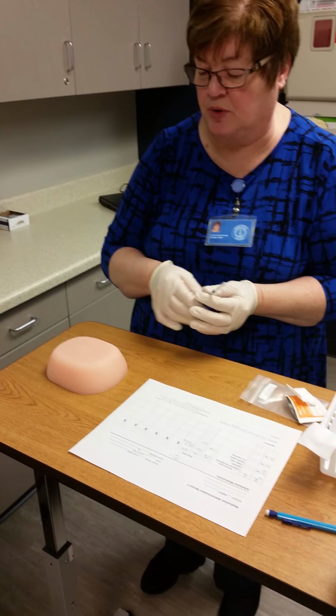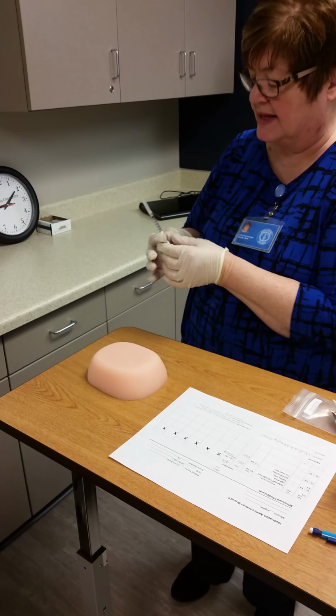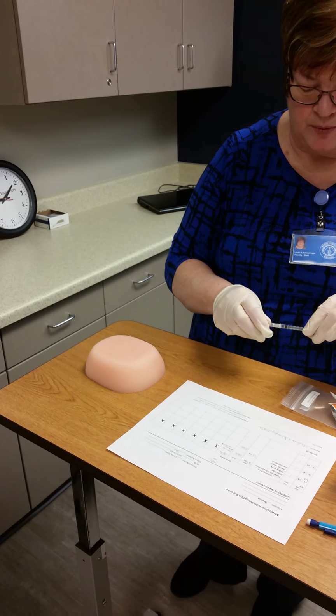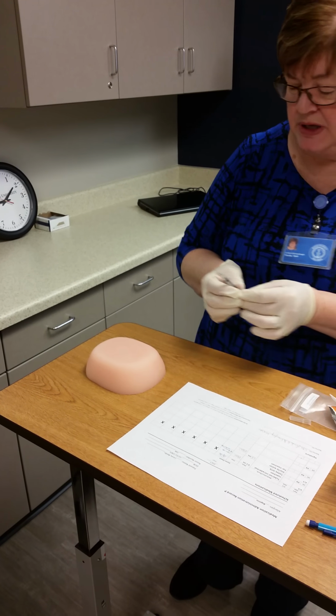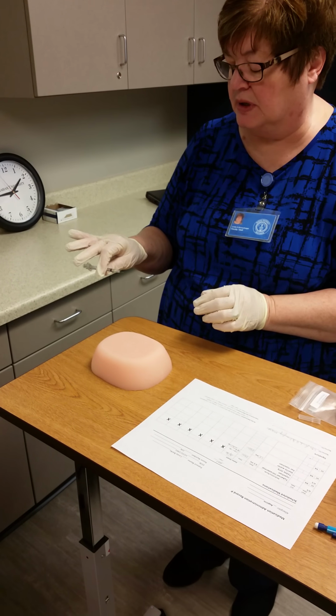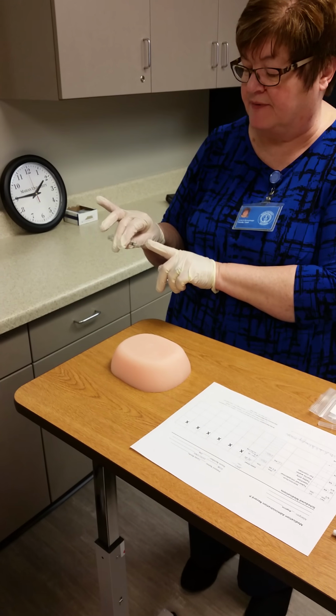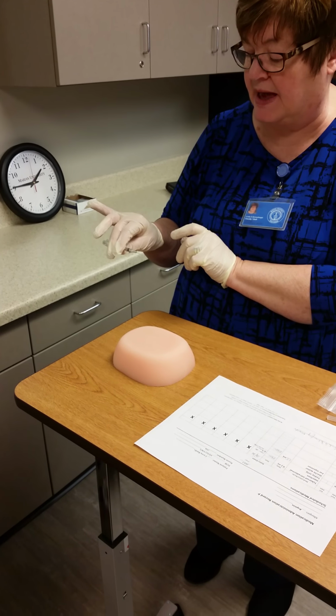Now in your book it showed them holding the under part of your arm and stretching the skin taut and coming in. That's one way of doing it. Another way to do it, for demo here that we'd like to see because of the equipment we have, is that you will make sure that your little finger does not go on the plunger at all. You need to make sure that the bevel is up and you're checking for burrs, which we have none.